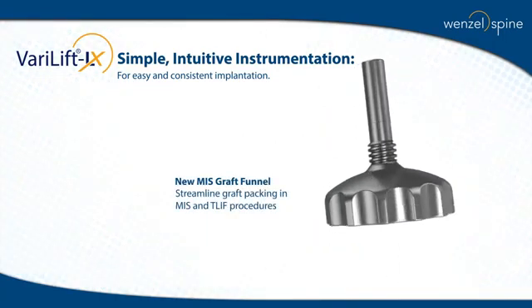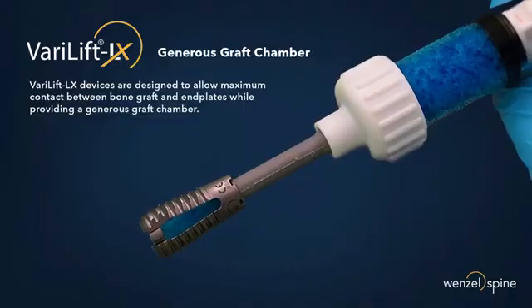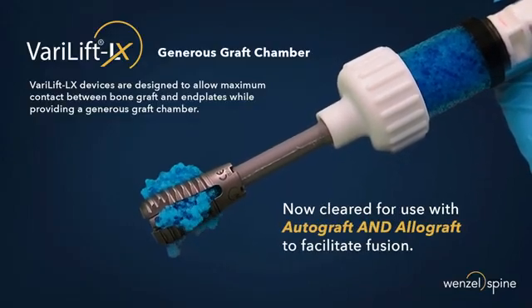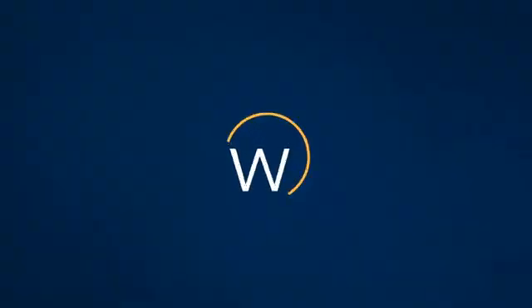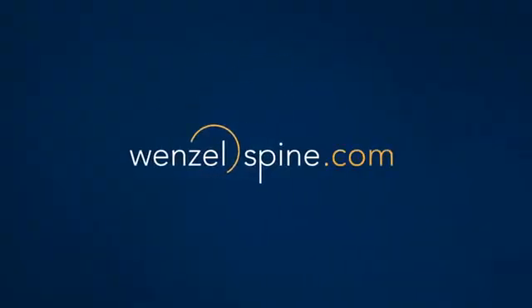The new MIS graft funnel streamlines and facilitates overpacking the device. Verilift ELEX is now cleared for use with both autograft and allograft materials to facilitate maximum fusion with the end plates. Visit us at www.wenzelspine.com to start simplifying spine in your practice today.